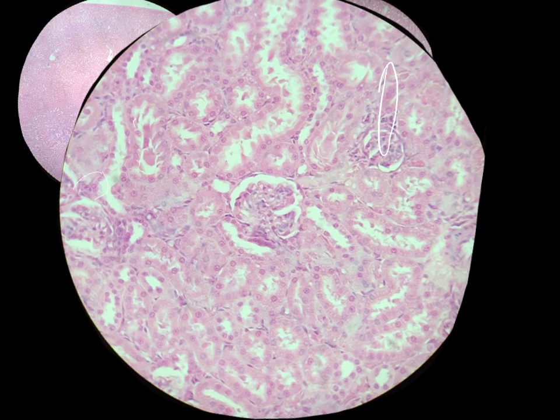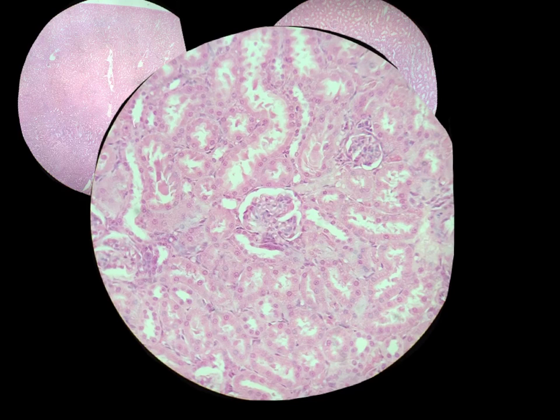And you can see them here. Get these all out of the way. And you can see we're on one glomerulus right in the center here. And you've got a nice proximal convoluted tubule. Let me switch colors there. Proximal convoluted tubule there. There as well. This guy here. So these are big tubules that always look like they have some kind of particulate in the middle. It's not this nice clean opening. And you can contrast that with this tubule here, which actually has a cleaner opening and is sitting right up next to the glomerulus. And that's likely a distal convoluted tubule. It's kind of a large one. Usually the DCTs are a little bit more circular. This could be one right here.